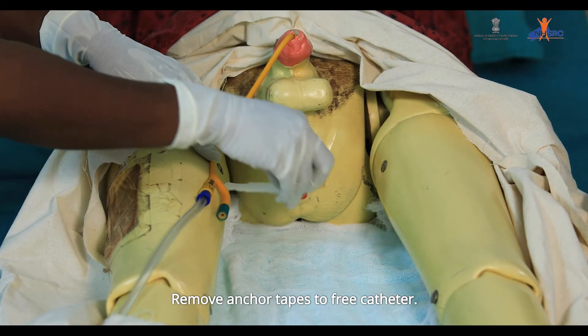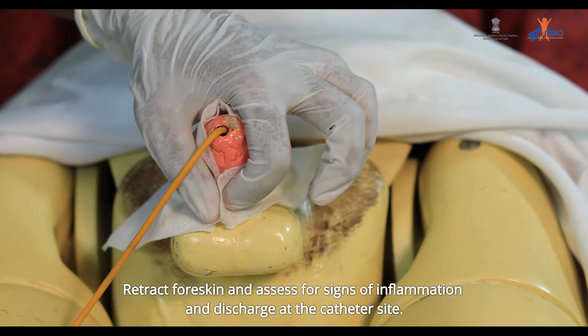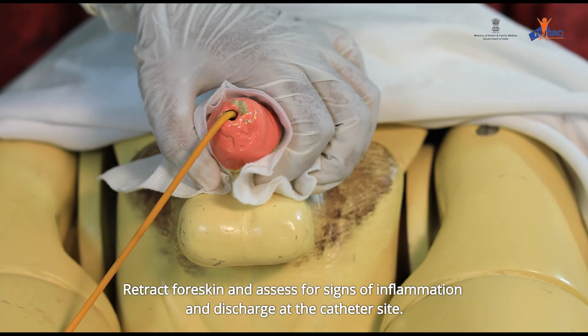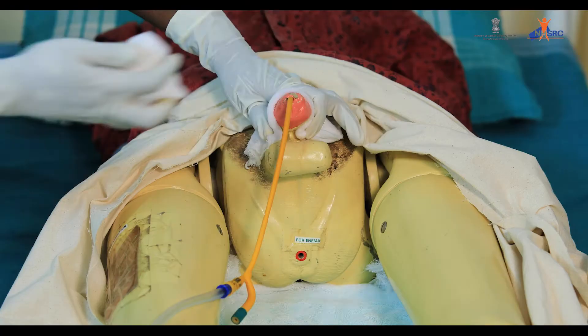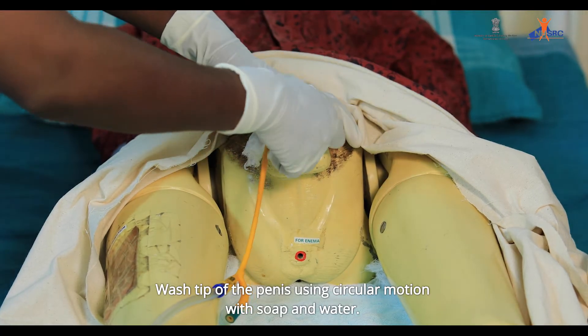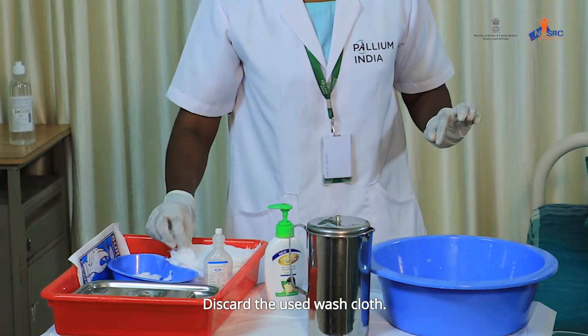Remove anchor tapes to free the catheter. Retract foreskin and assess for signs of inflammation and discharge at the catheter site. Wash the tip of the penis using a circular motion with soap and water. Discard the used washcloth.